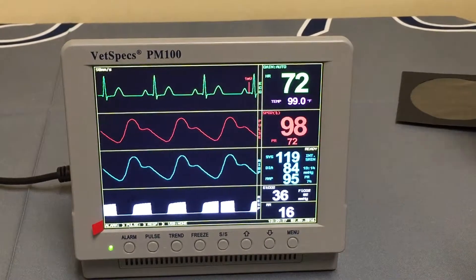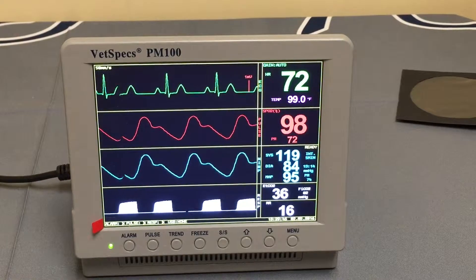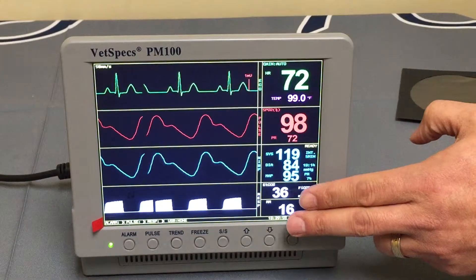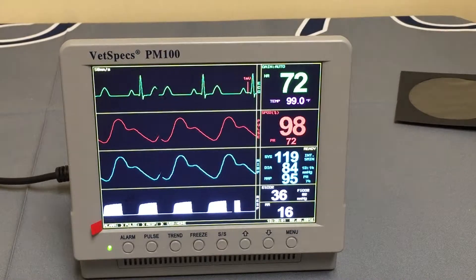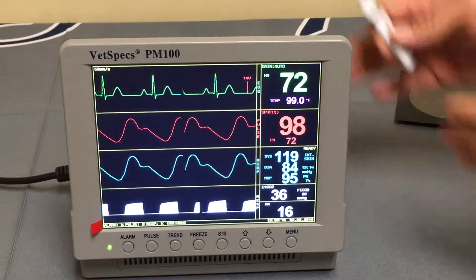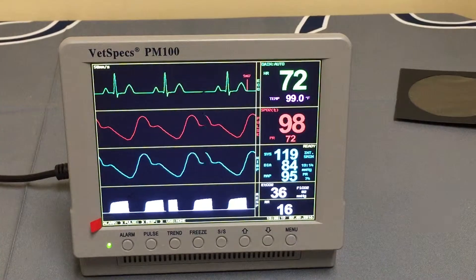Assuming everything is hooked up to a patient — this is a full demo mode showing how the screen would look with all available PM100 parameters attached: ECG with heart rate, temperature, pulse ox, non-invasive blood pressure, end-tidal CO2, and respiration. All of that data is being saved as we speak to the internal memory of the monitor. In essence, you have an internal temporary memory, and the USB flash drive will essentially be a backup to that internal memory.